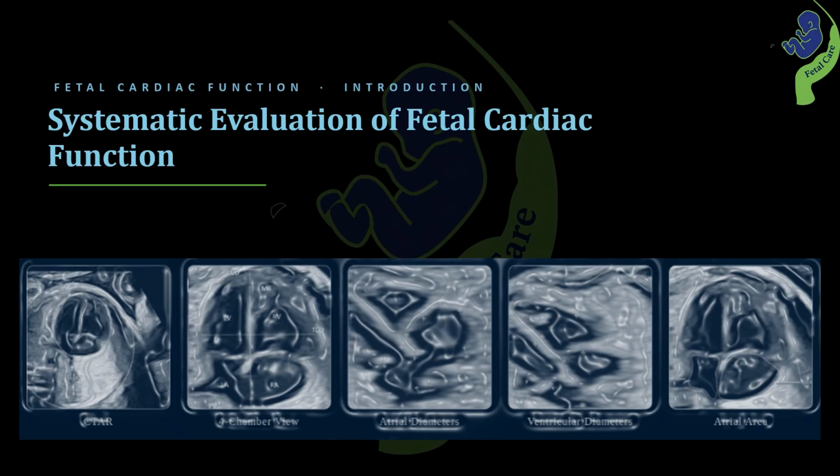It is a well-known fact that evaluating fetal cardiac function is one of the more challenging parts of fetal medicine. To make it simple and easy to practice, we have started this series of systematic evaluation of cardiac function. This is part 1, where we will go through various morphometric measurements of fetal heart. And I hope by the end of this series, you will all feel confident enough to bring this measurement of cardiac function into your daily practice.